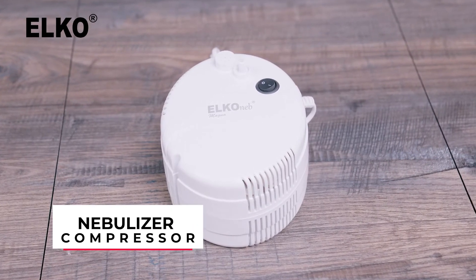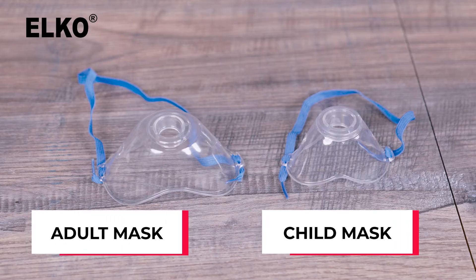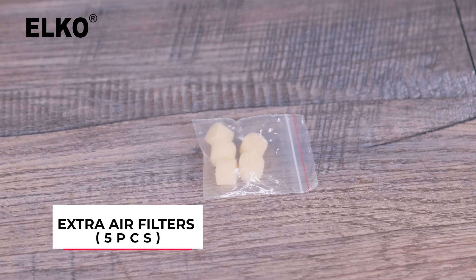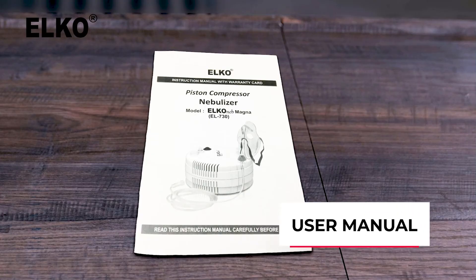A machine called the Nebulizer Compressor, a Nebulizer Chamber, a mouthpiece and two mouth masks — one for a child and another for an adult user — an air tube, five extra air filters, and a flow controller. You will also receive an elaborate user manual.